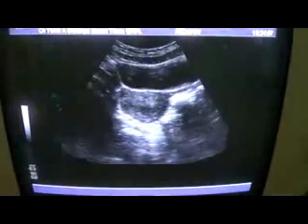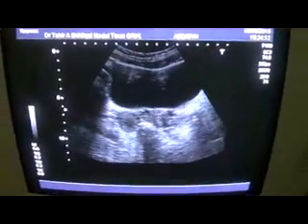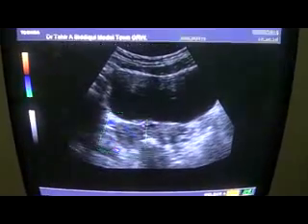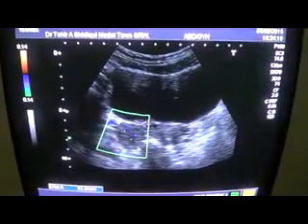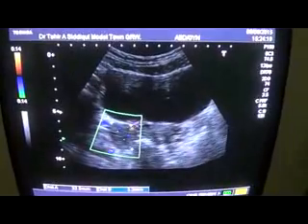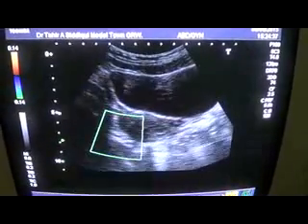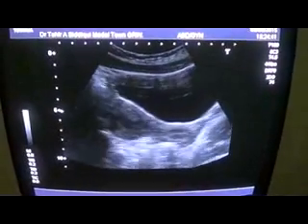Okay, and this area, this area is the ovary. This one, let me show you. This is the ovary, right ovary. You can see follicular development in a very early stage, and the ovary measures approximately 32 by 23 millimeters, which is normal. No myometrial mass seen, fine, okay.